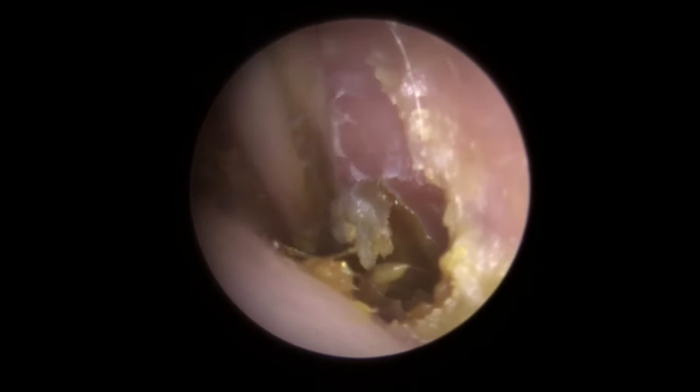And so we've come to the last patient in the compilation. What you can see here is a very, very blocked up ear canal. Lovely gentleman, a young chap came through — he'd failed his hearing test at work, so needed his ears cleaned out. Lots of history with ear, nose and throat. What you can see is we've got a very, very large piece of wax here. The patient was a little bit jumpy, a little bit nervous, which is why you see a little bit of movement to the camera. So what we're doing here is using the suction just to try and get a good grip on this front section — not a tremendous amount of forward movement, which would normally indicate quite a long piece of wax in here.